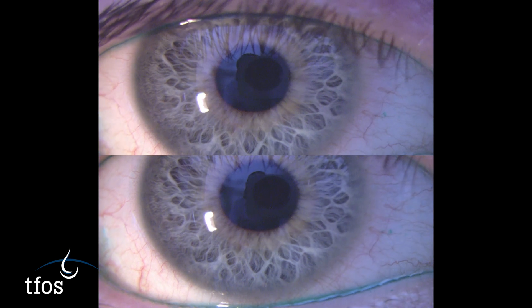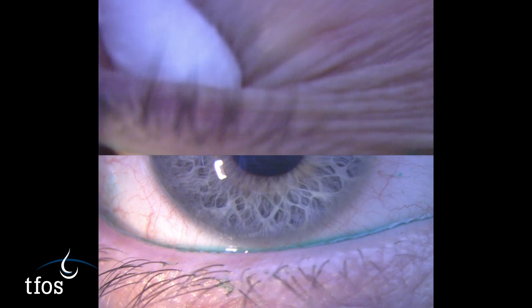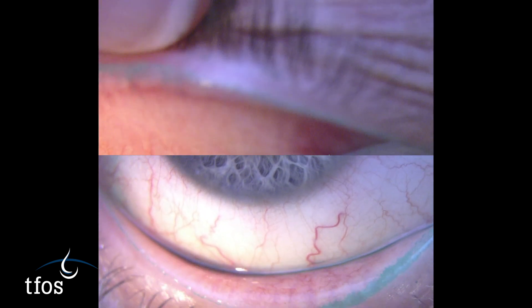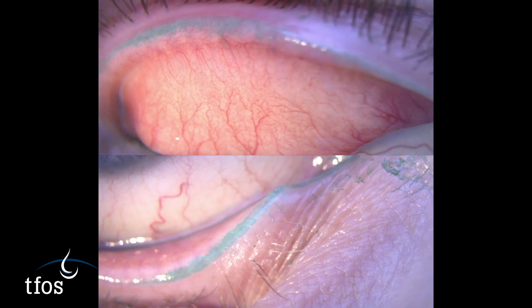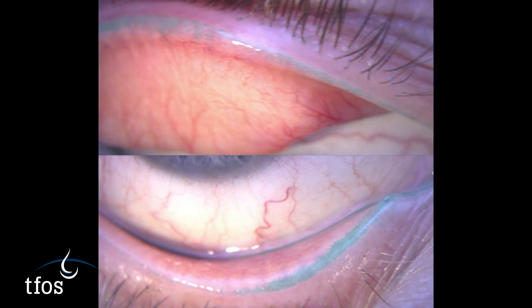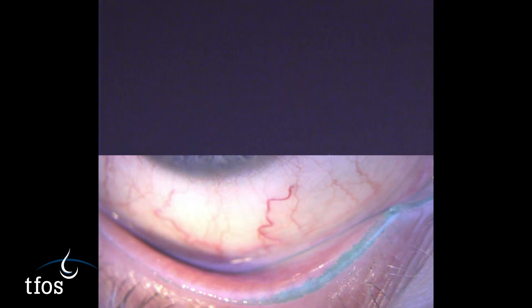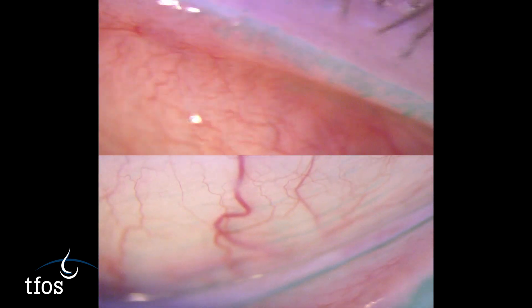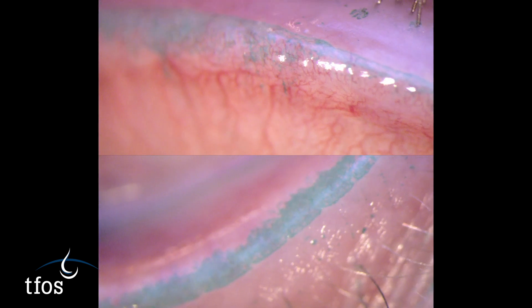The lid should subsequently be averted to reveal any damage to the lid margins, which will have been stained with the fluorescein and lissamine green already instilled in the eye. A positive diagnostic result is a lid wiper epitheliopathy score of greater than or equal to two millimetres in length and/or greater than or equal to 25% of the sagittal width, excluding Marx's line. A validated grading scale can be used to monitor changes in the staining severity over time.